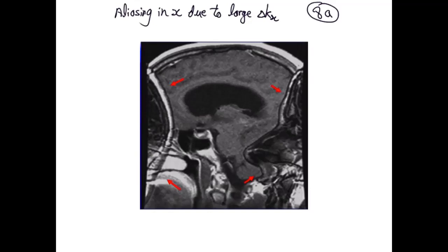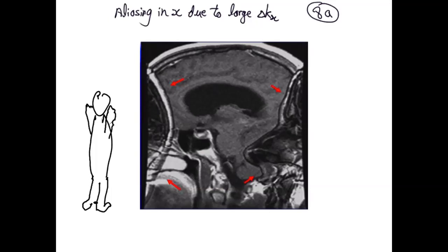I'll show you some other time. I actually don't have the image with me, but here's a case where we had a pediatric patient lying in the scanner, and that pediatric patient had a tube of infusion connected to their arm, because they were under sedation. So let's draw the tube here. Normally, if you have a good technician, the technician would take the tube, put it really close to the body, and then connect it to the subject. But in this particular case, the technician put the tube over here.